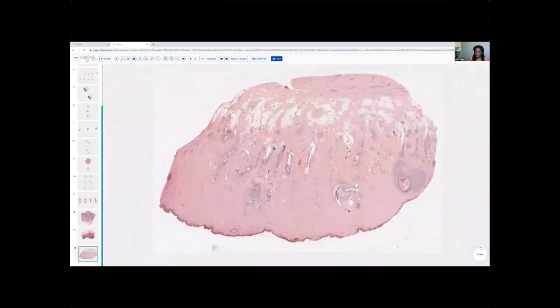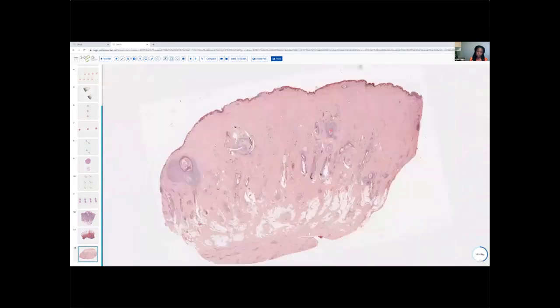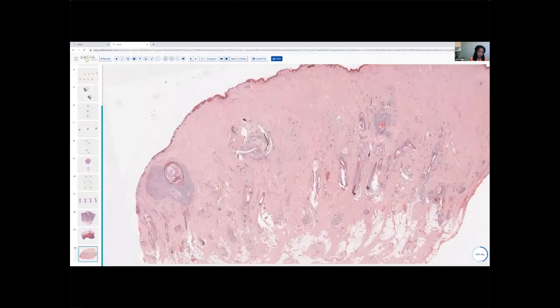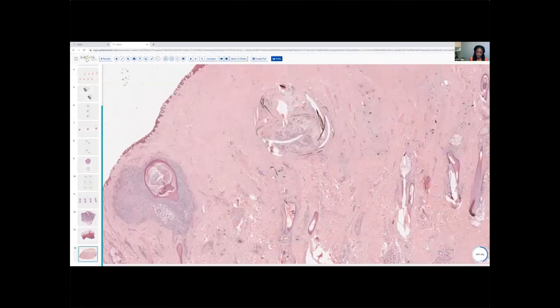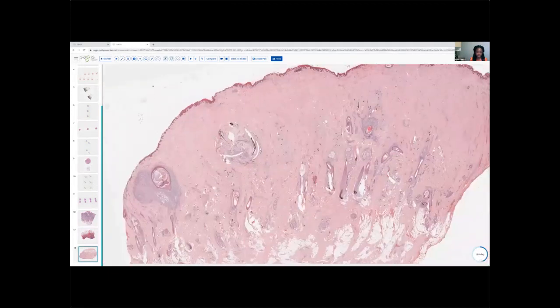Okay, so I'm going to tell you that this is the same condition, same diagnosis. So we're seeing that same scenario where we have these free hairs, but we just don't have that robust inflammation quite as much. We have our follicles, in this case, with some sort of plugging going on, and there is certainly peri-follicular inflammation here, but we also have these more chronic zones where the inflammation isn't quite as profound, but instead of inflammation, we now have this kind of scar.